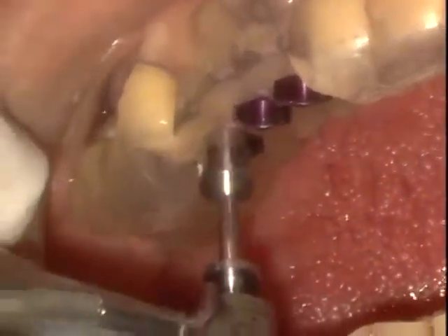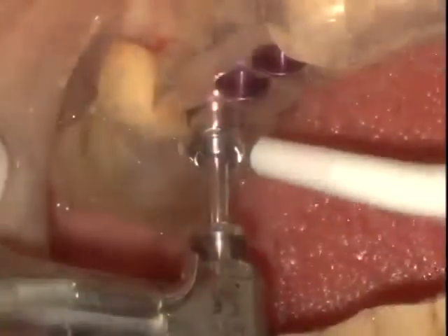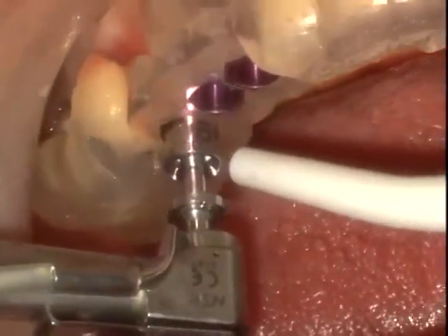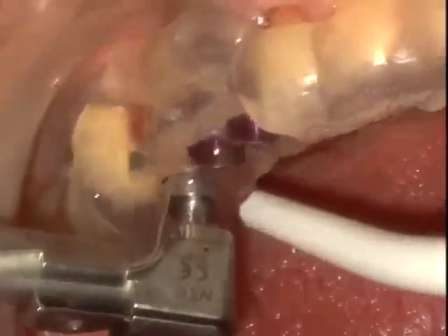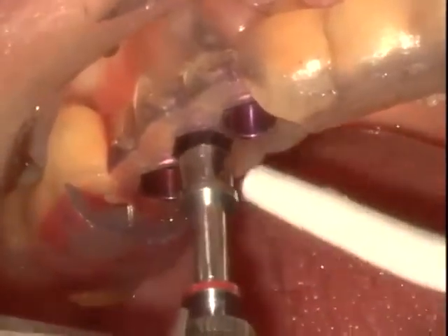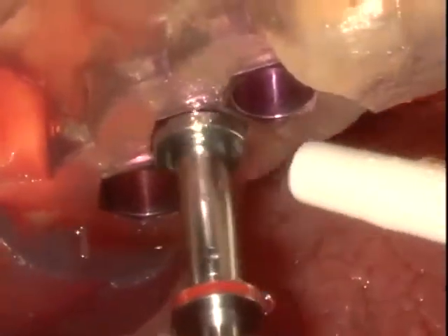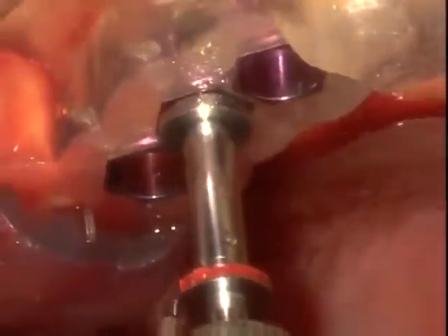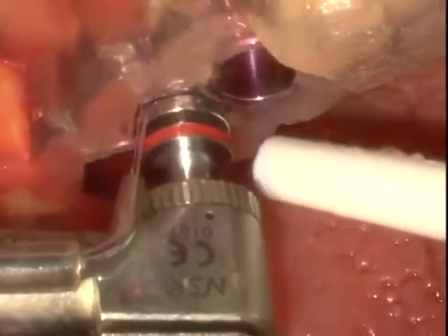So each one of these drills has to be accessed through a sleeve that is in precise fit to the surrounding sleeve in the surgical guide. This guide never needs to be removed. The optical scanning allows us to have a precise fit on the adjacent teeth, so this is very stable, does not move, and allows for very, very precise drilling of the osteotomies in all 3 dimensions. To me, this is certainly the future in dentistry, being able to plan the case completely through a combination of optical and digital scanning.